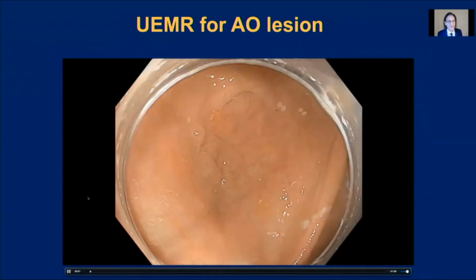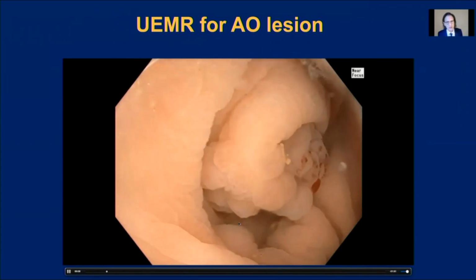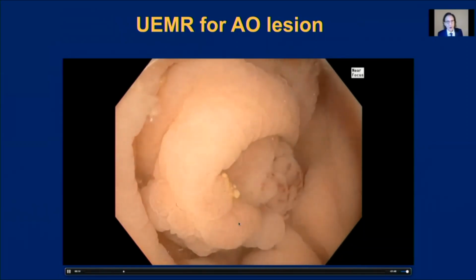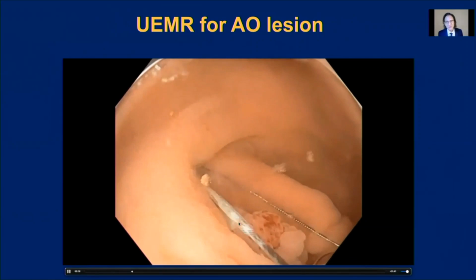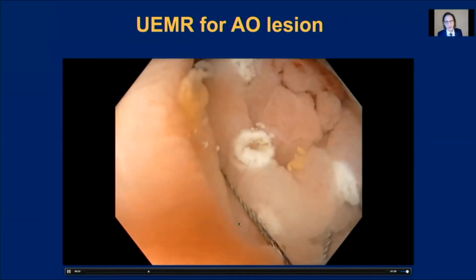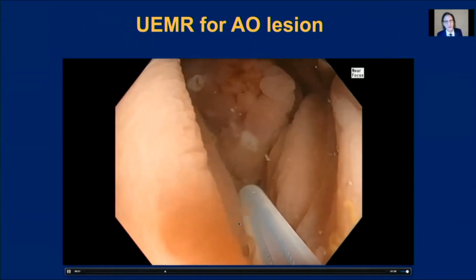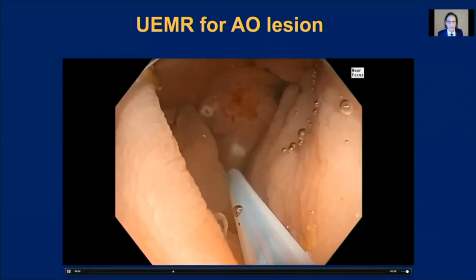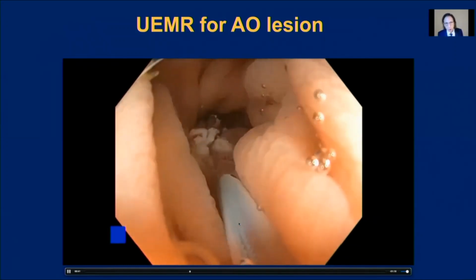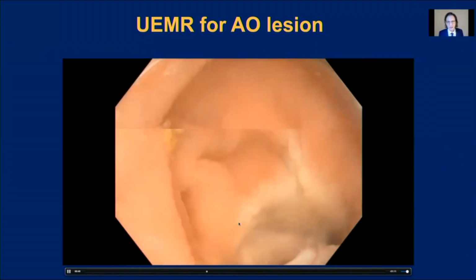Here's an illustration of UEMR for an AO lesion. So this is a lesion that encircles the AO, but also extends into the AO. But when we give water, the part that's inside of the AO floats very nicely out into the lumen and allows us now, after we've performed our diathermic markings around the lesion and it's all nicely contracted, to encircle the lesion with our snare. So once again, we are attempting en bloc resection. We close the snare, we look. We can always open the snare again and recapture if we're not happy with the capture.